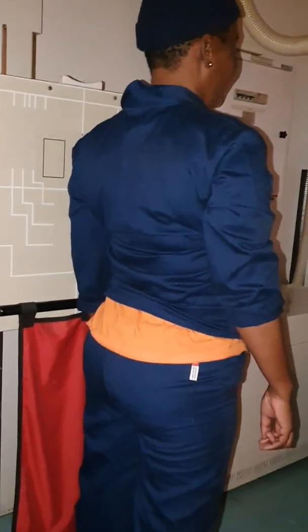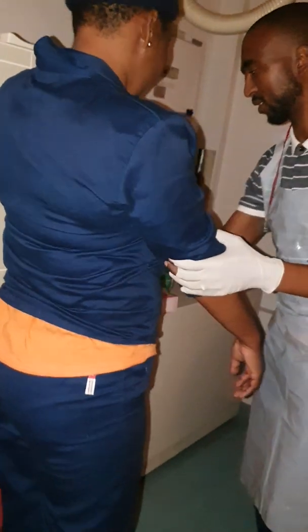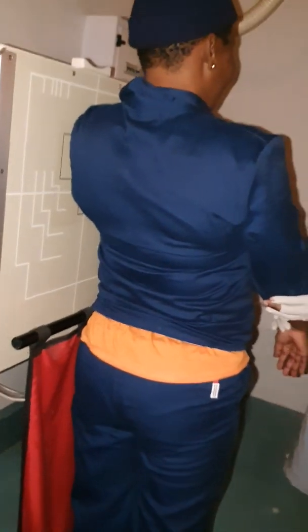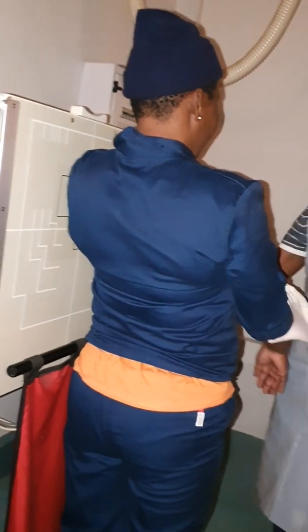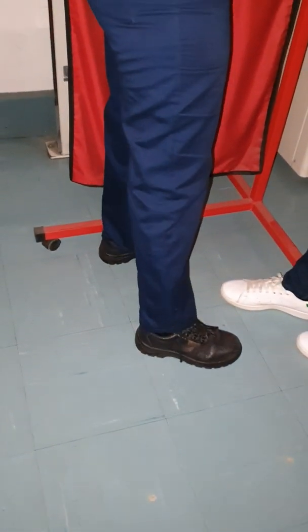Your patient will stand with their left side of the body in contact with the erect Bucky. You will ask your patient to lift their hands up above the head, hands on the head, elbows together. Feet slightly apart for immobilization.